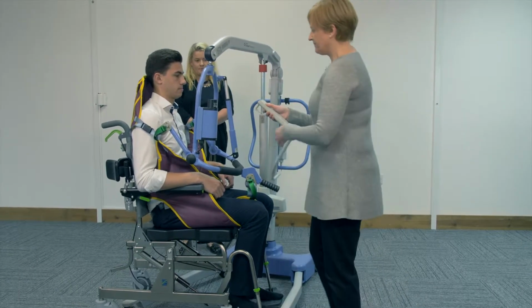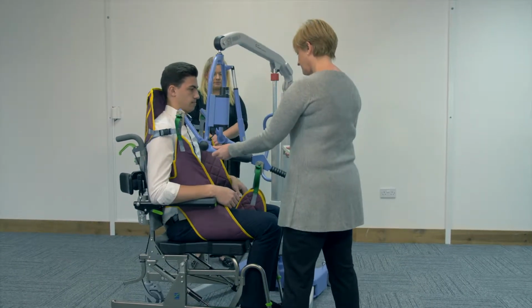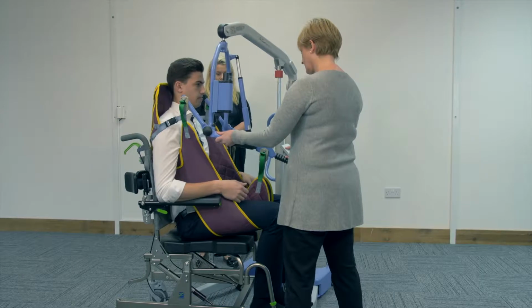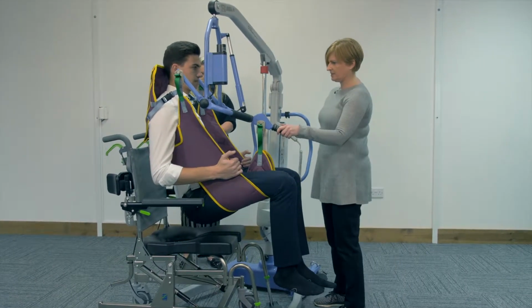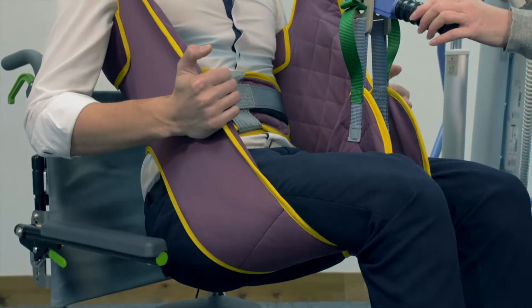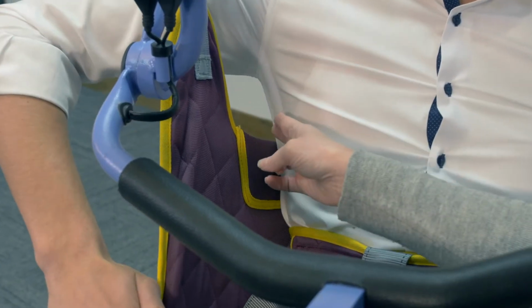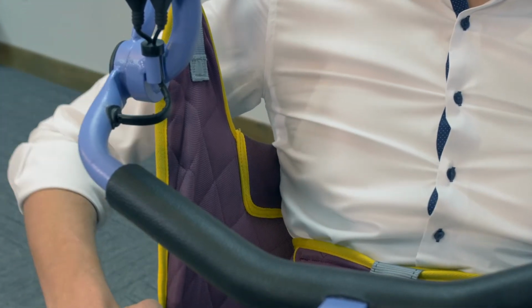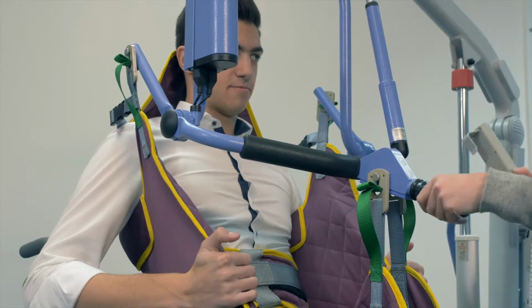Then if we lift the user up with the hoist, you want to see a 2-finger gap between the top of the sling and the armpit on both sides to make sure that it's not causing any pressure.